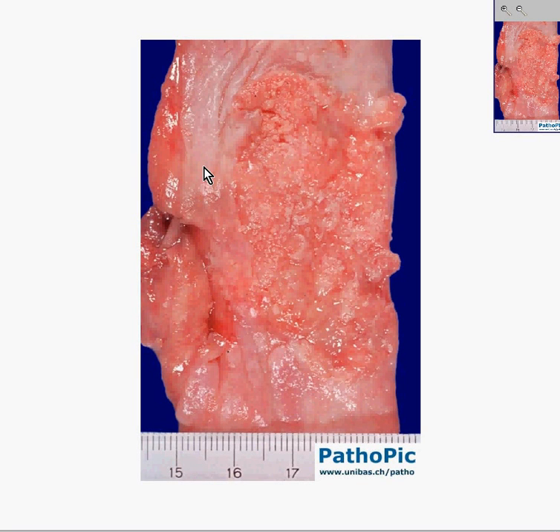Here is another esophagus. Whenever you see this shiny and thicker looking and less mucousy type of mucosa, you can always bet that it's probably squamous. This is the normal squamous mucosa of the esophagus all throughout here and here by characteristic appearance. Notice it's rather normal out here as well.